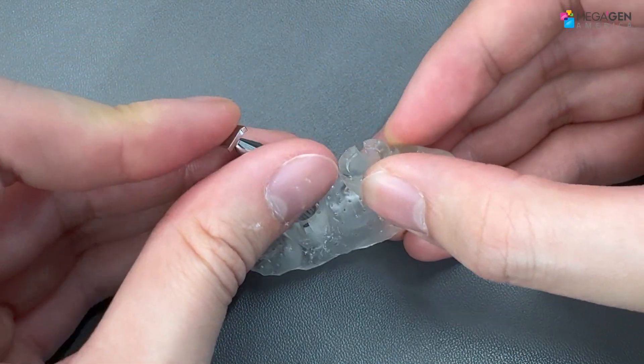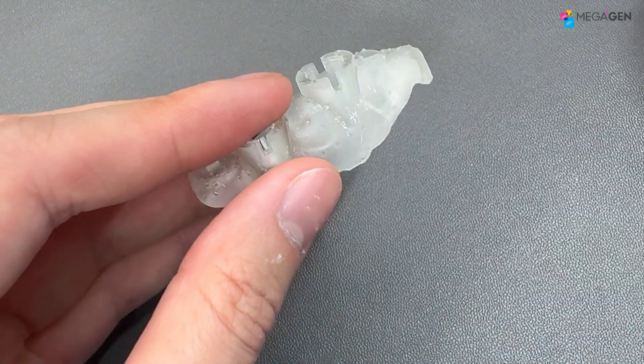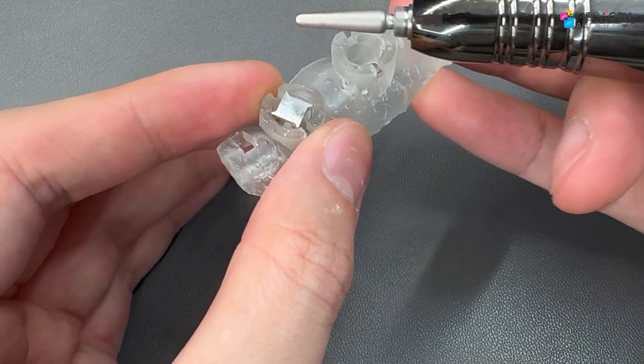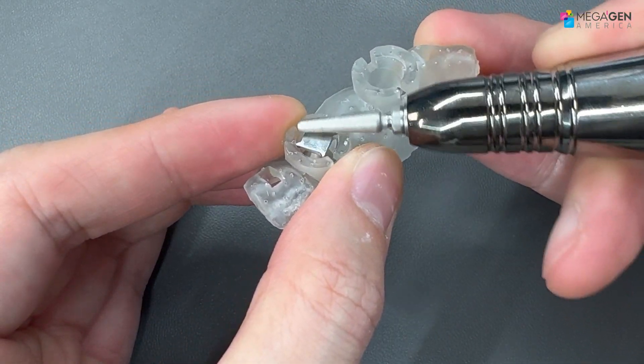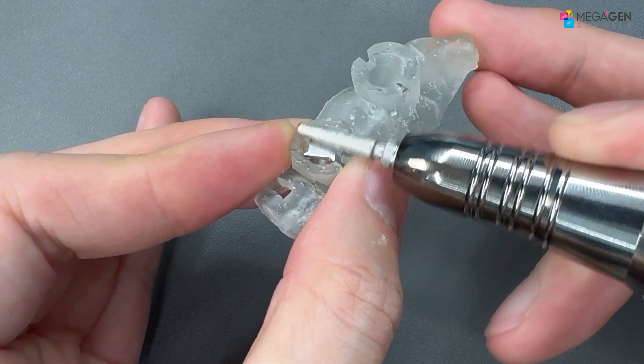The next step is to trim any bumps made from the support. If you have a burr, you can smoothen out the bumps carefully, making sure the drill holes are not touched.